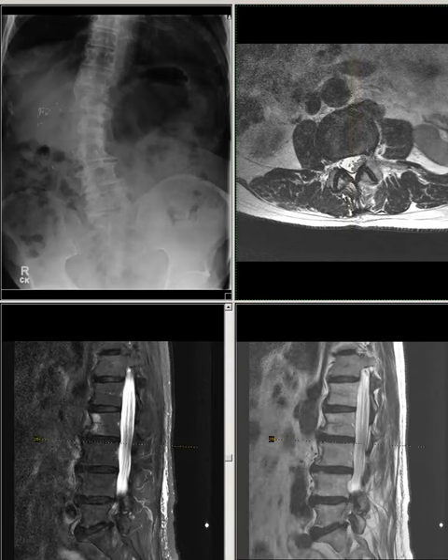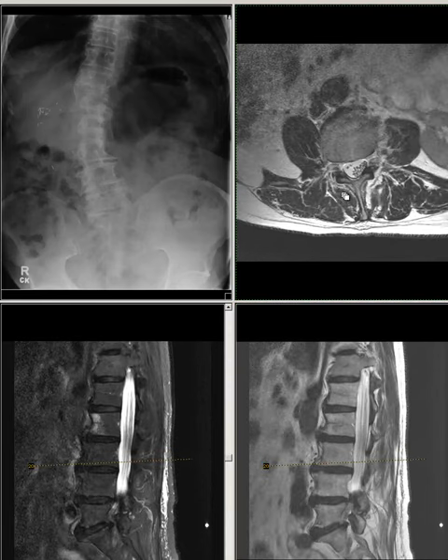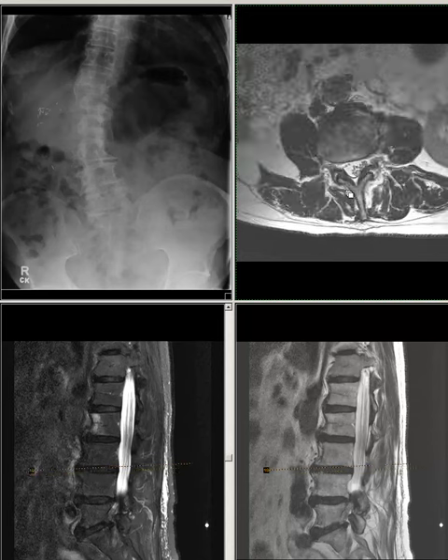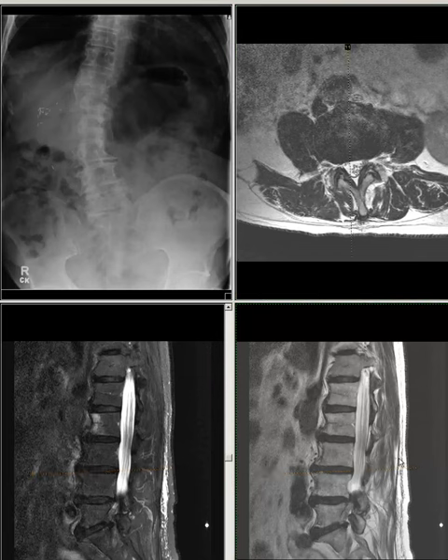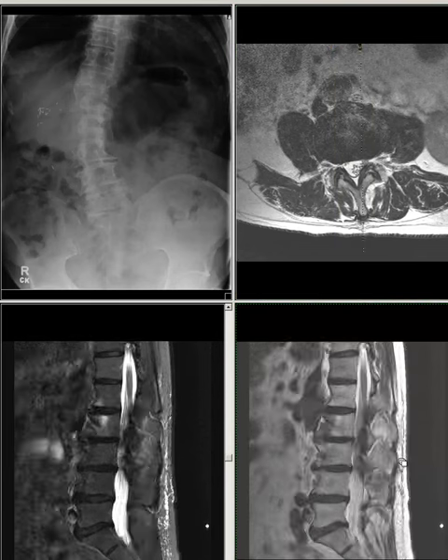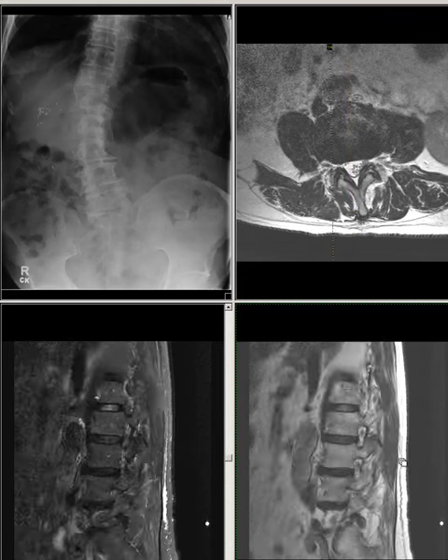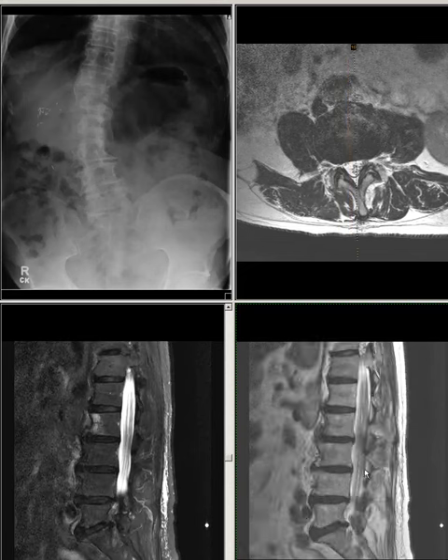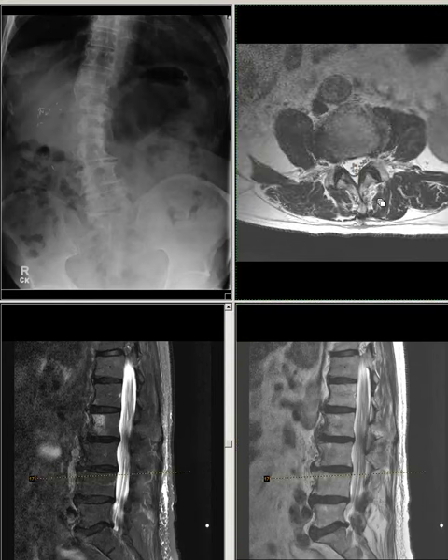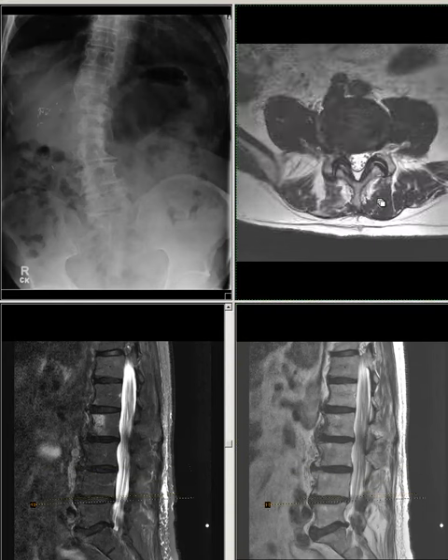L3-L4: There is disc desiccation and bilateral disc-osteophyte complex with facet joint hypertrophy bilaterally noted. There is mild bilateral neuroforaminal stenosis without direct nerve compression.